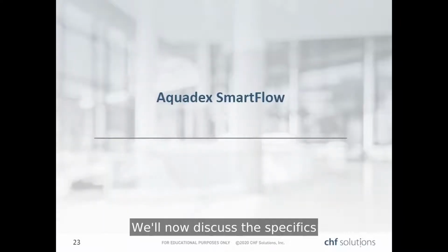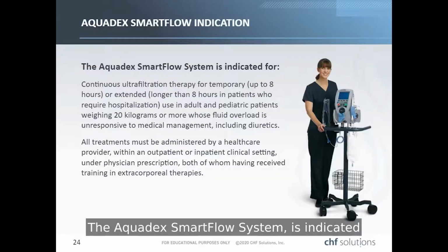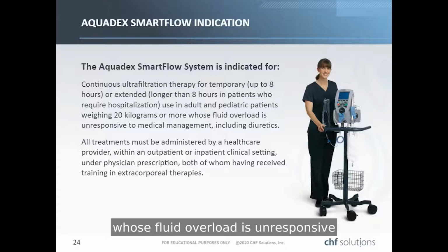We'll now discuss the specifics of the Aquadex SmartFlow system. The Aquadex SmartFlow system is indicated for continuous ultrafiltration therapy for temporary or extended use in adult and pediatric patients weighing 20 kilograms or more whose fluid overload is unresponsive to medical management, including diuretics.